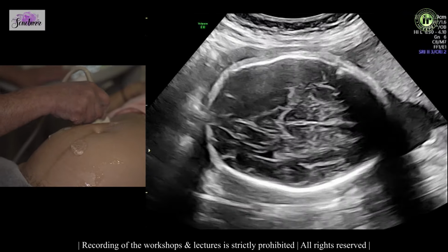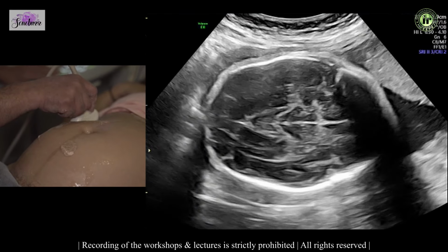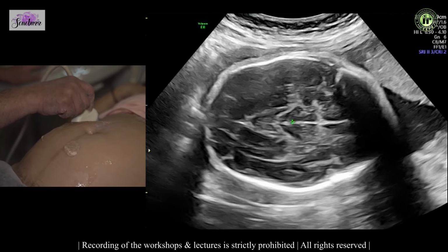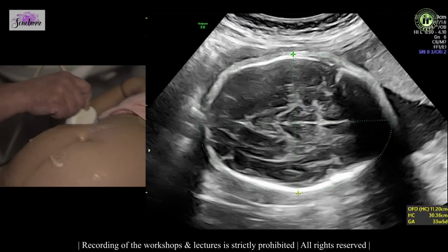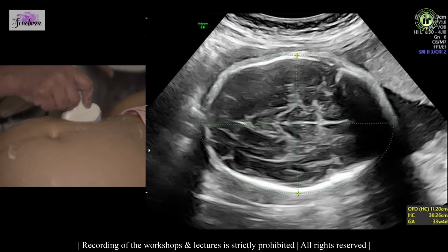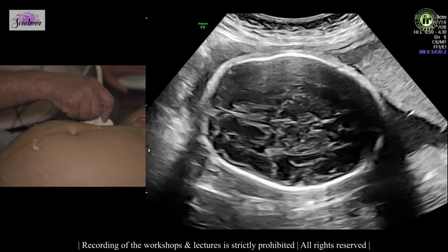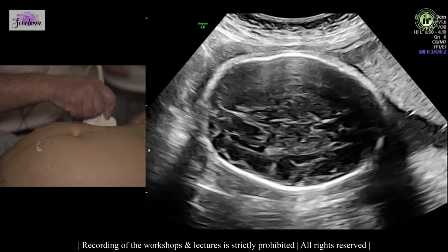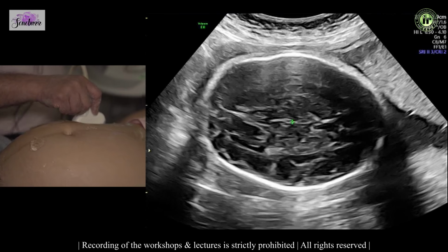This is the axial view, the typical transthalamic view, where we measure the BPD and the head circumference. And then we move to a slightly higher plane, where we look at the parieto-occipital sulcus and we measure the lateral ventricles.